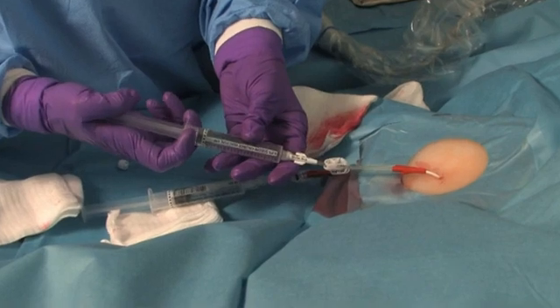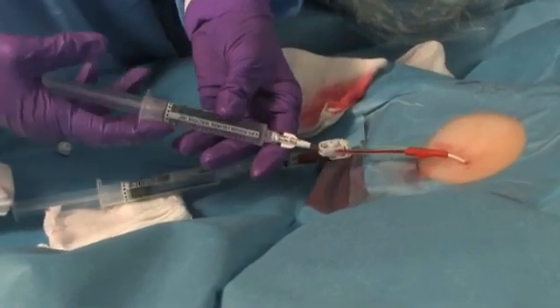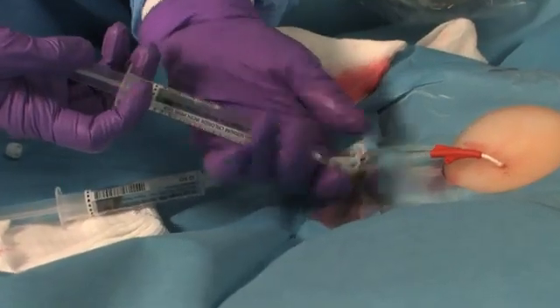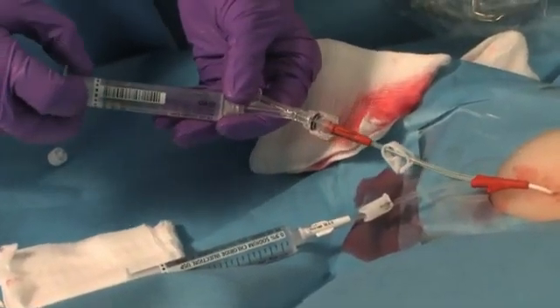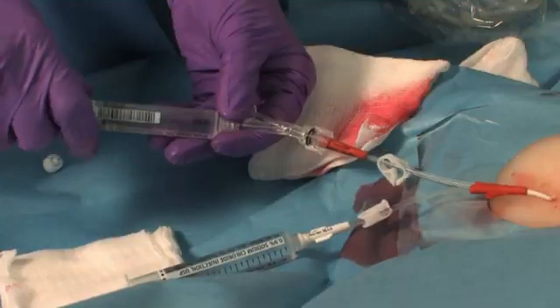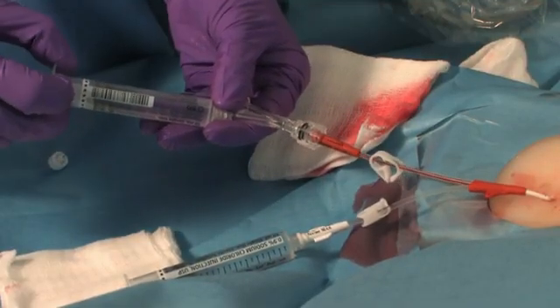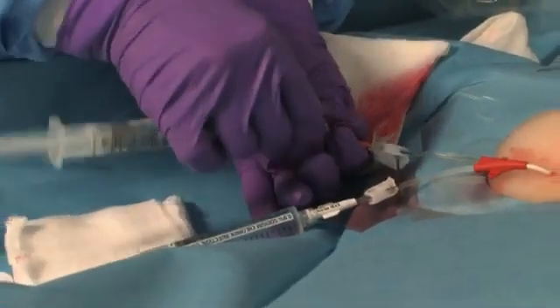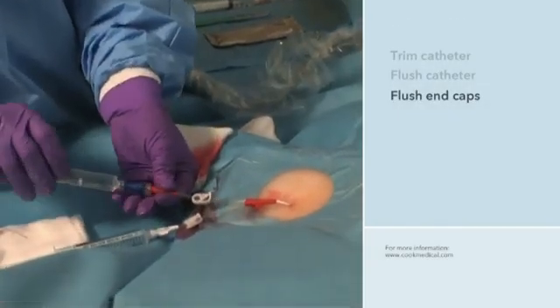With the catheter now in place, she aspirates and flushes each lumen and checks for blood return. She asks the patient if she can hear a whooshing sound in her ear when the lumen is flushed. If no sound is heard, it is unlikely that the catheter is malpositioned in the jugular vein. Once blood return is confirmed, she removes the obturator and sidearm fitting and places end caps on the PICC line. She uses sterile saline to flush the end caps.